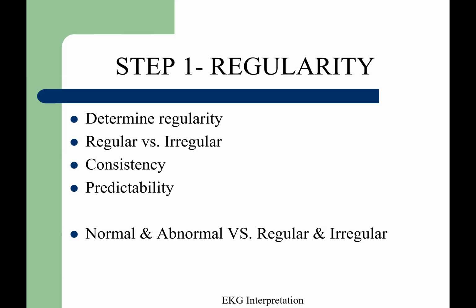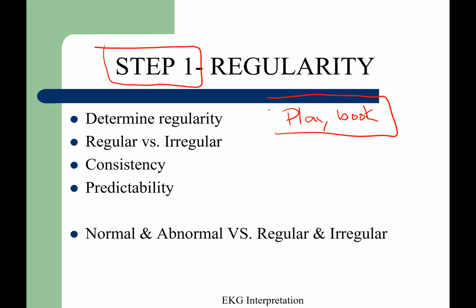So now the first step that we're going to do is check for regularity. The reason I say step one is that we're going to approach this as a playbook, or think about it like a recipe. I'm going to help you develop this playbook, so that you can follow procedures to make the best assessment and the best analysis of an EKG. The first thing we're going to do is step one, which is check for regularity.